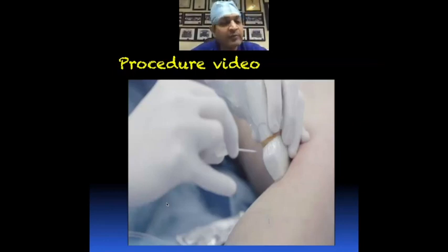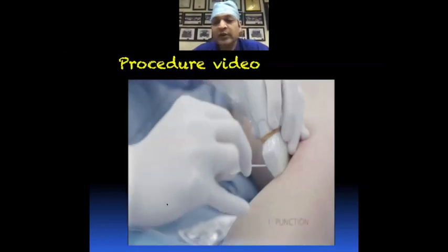Normally, if you burn the vein properly, you just have to press the insertion site for maybe 30 seconds and there will be no bleeding. If you look into all the other methods, there will always be bleeding from the sheath, except the laser, where sometimes if you do proper laser, you don't get any bleeding at all from the sheath entry point because the vein really occludes very well. So let's see this procedure video here.